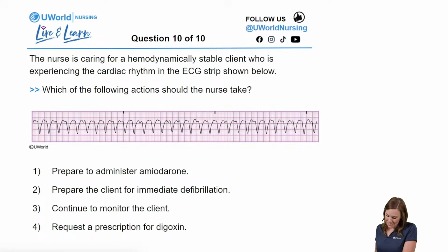Let us know. Good work. Good answers. All right. Let's see what you think. 30 seconds. I'm seeing a good mix of both of these answers. Again, not too late to follow us. Oh, here, you guys are going fast. Let's see what y'all think. All right. Tricky. This was a little bit of a trickier one, but we'll walk through it together. All right, I will pull up our answers.